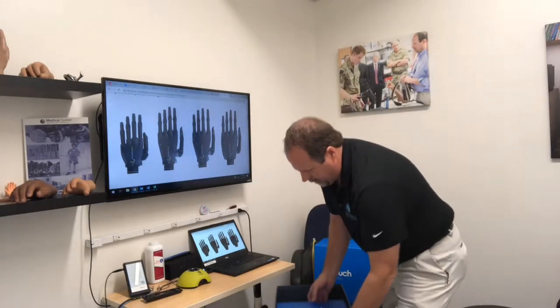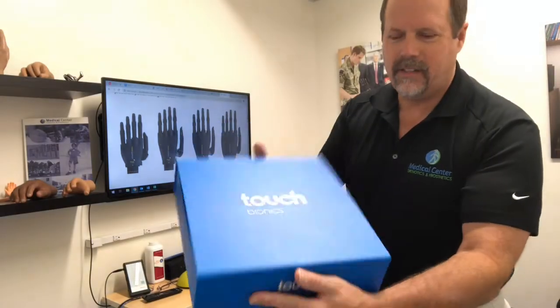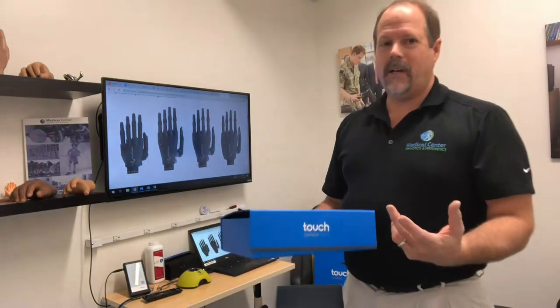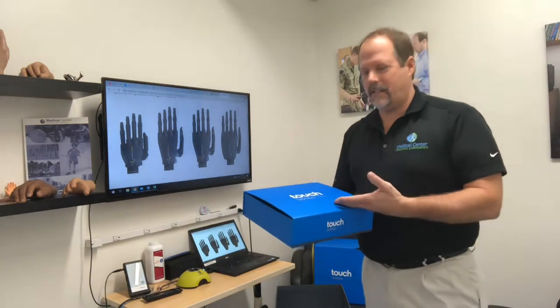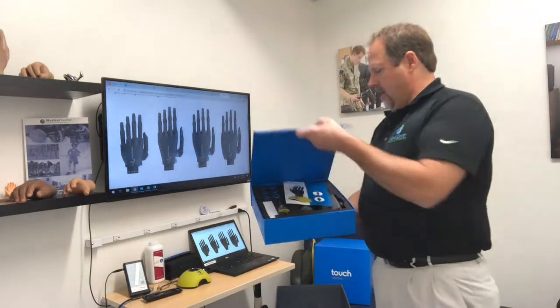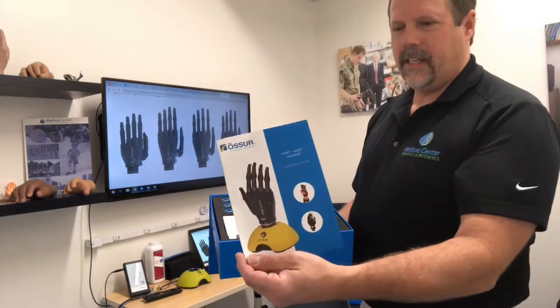The next thing we come across is this nice little blue box from Touch Bionics. It has a nice little magnetic opening — wonderful packaging by Touch Bionics. Most people won't see this, it'll be on the back end as prosthetists will see. But as a prosthetist, it's nice to see the quality of the packaging here. It's a quality product too. So we'll open this up and remove the little pamphlet on the iLimb.